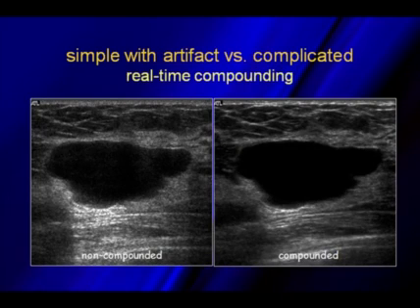So we were able to partially clear out some of the internal noise just by using harmonics on this particular cyst. Here's another example of a breast cyst that we can see some internal noise on. This one is slightly lobulated, and you can see that the TDLU can go through these lobulated changes.